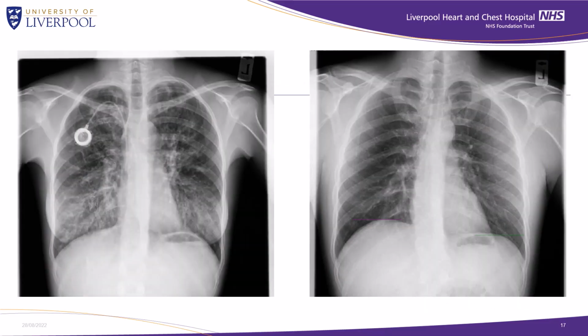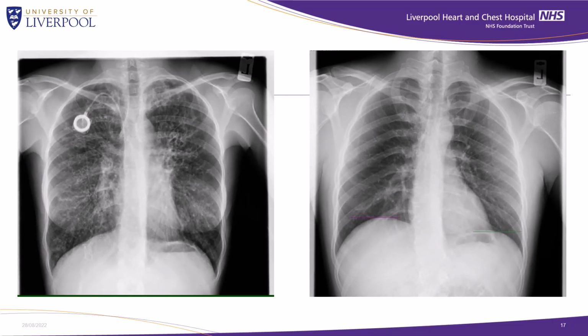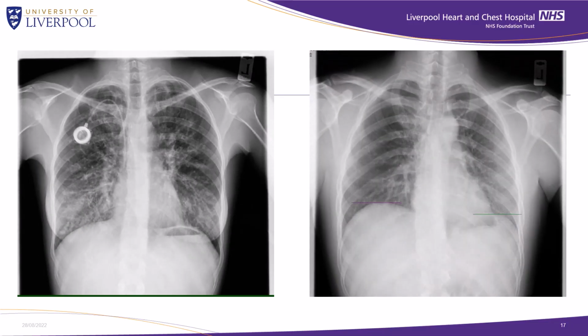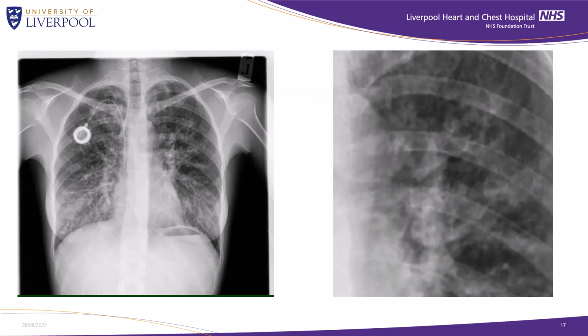Example of the kind of imaging we have acquired. On the left is a DDR of a 32-year-old female with CF bronchiectasis. Compare this to a DDR of a similarly aged healthy individual on the right. The change in lung area is much less pronounced. Interestingly, in the individual with CF, when enlarged, you can actually see the change in end-on bronchiolar diameter during inspiration and expiration.